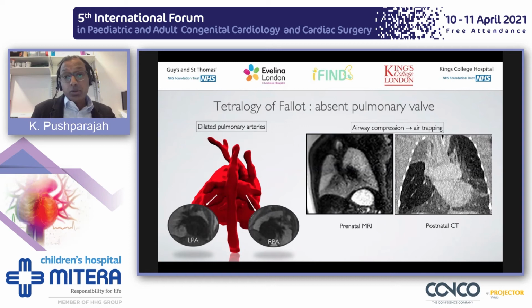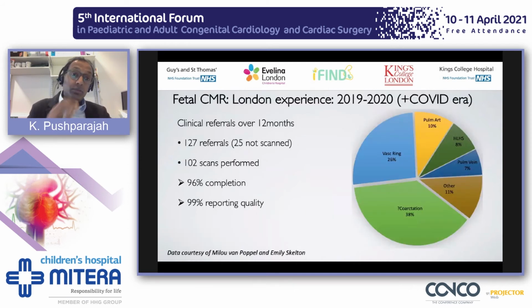So you can prognosticate. Even if you don't have the ability to do a complex heart MRI, as a cardiologist, if you see this, send the patient to your radiologist to at least look at the lungs for you, because it'll help guide your decision making.